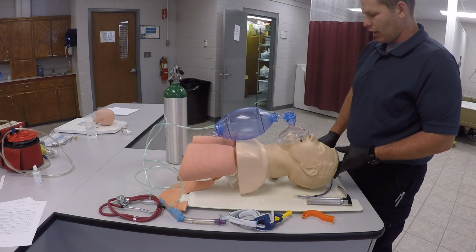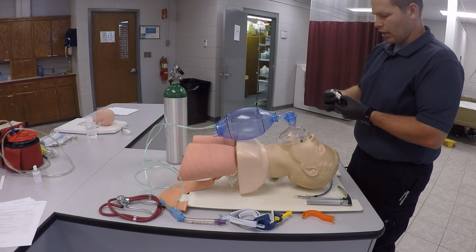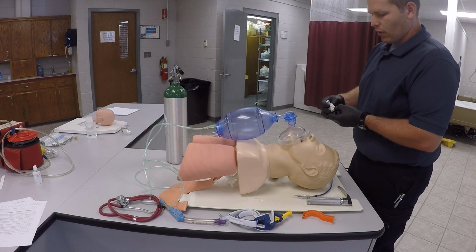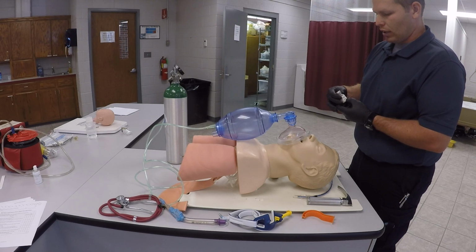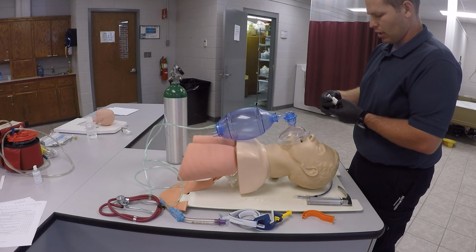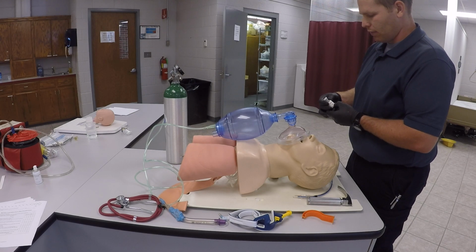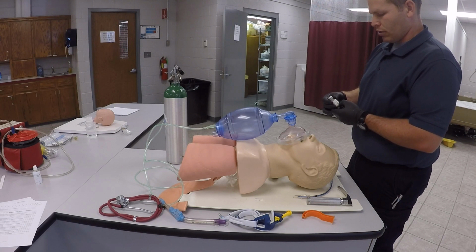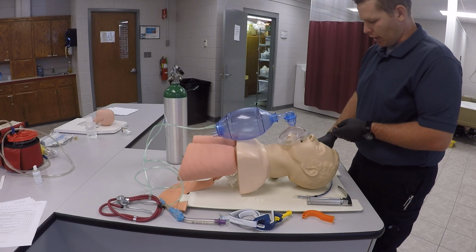Then we're going to look at our medications. And we're going to be giving etomidate here for a sedative. And we're going to check the 5 rights, make sure it's the right patient, the right route, which we're going to give IV, right medication, which is etomidate, right dose, and that'll be protocol specific. And then also we need to be checking our expiration date and clarity for that.